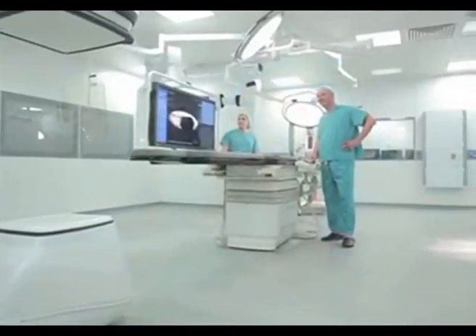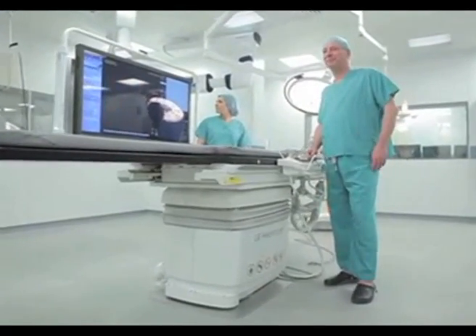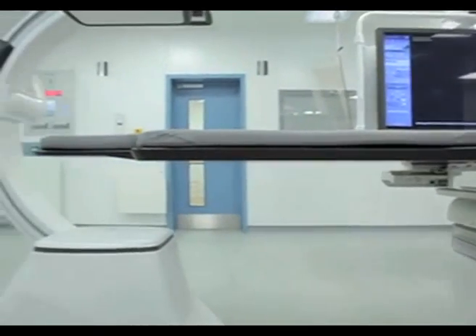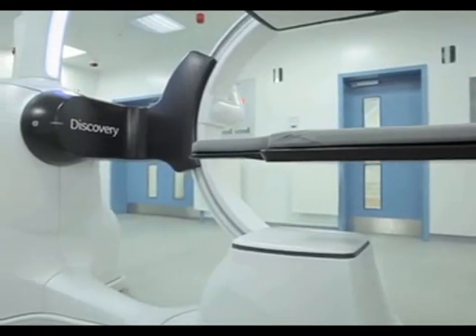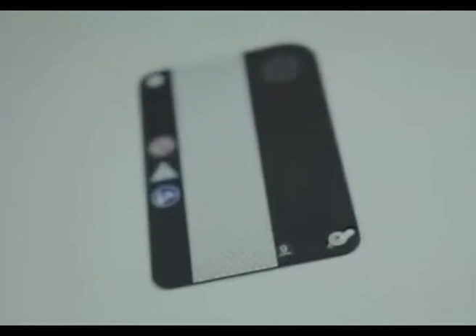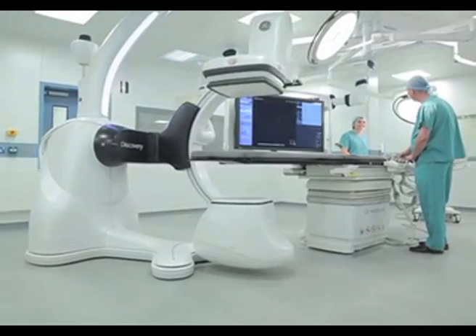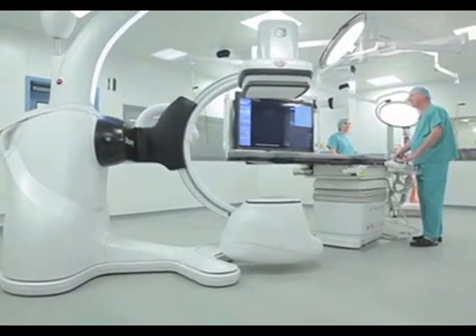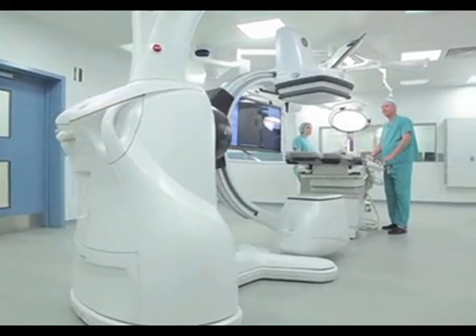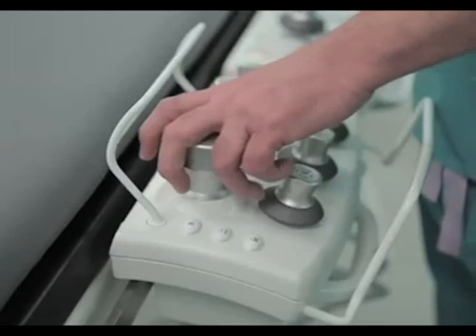As endovascular and vascular surgeons, we have always liked mobile imaging systems. They're easily moved out of the way when we need access to the operating table. The GE Discovery makes that possible. It is self-driven, laser-guided, and it can be moved away from the table and back to the table when imaging is required.